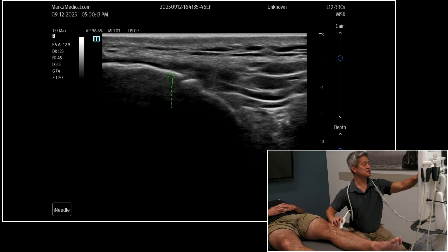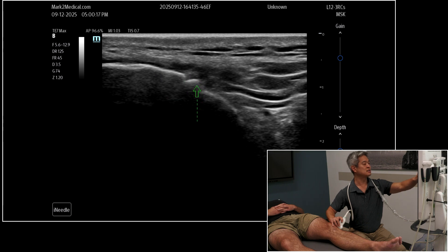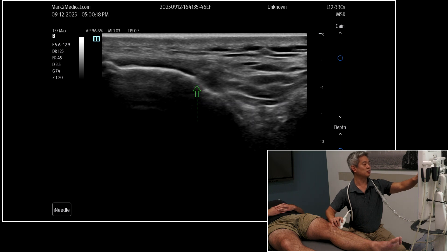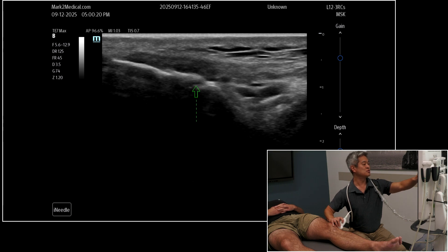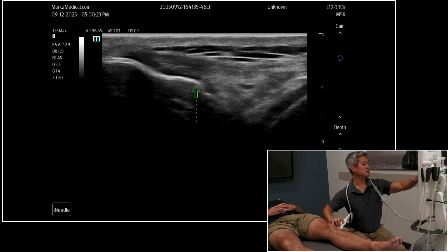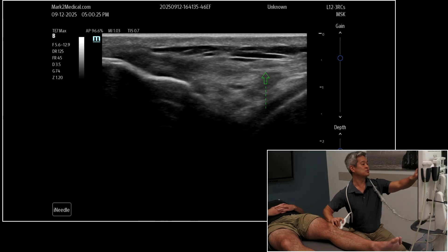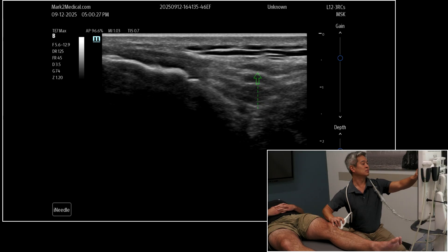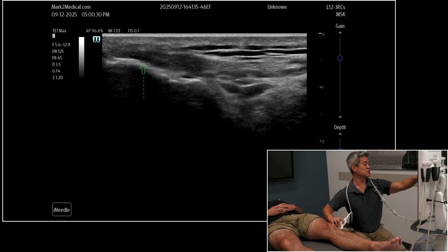Now where this attaches is actually on the medial aspect of Gerdy's tubercle. So if I continue to go laterally, then you're going to see the IT band — the iliotibial band — which is this thicker structure right here. So this is the iliotibial band coming down on Gerdy's tubercle.